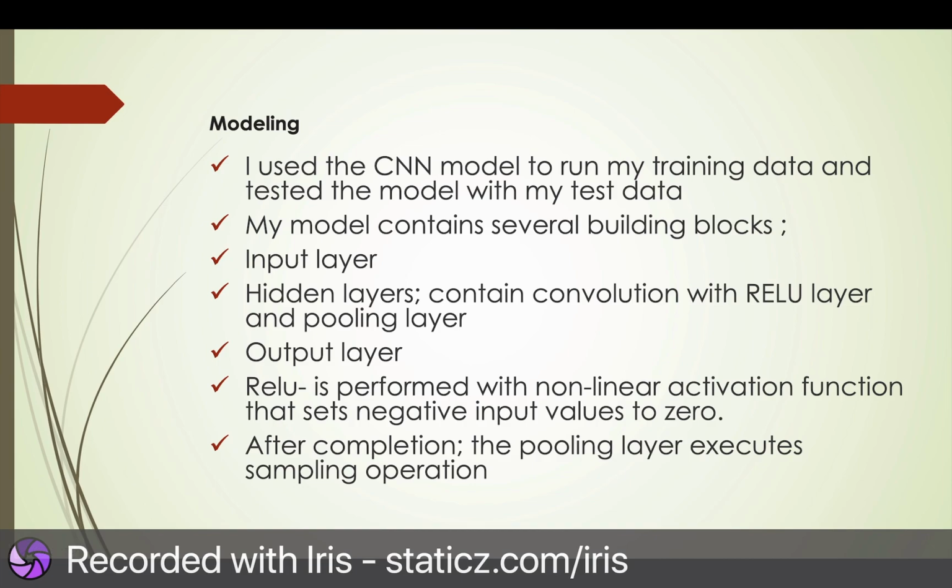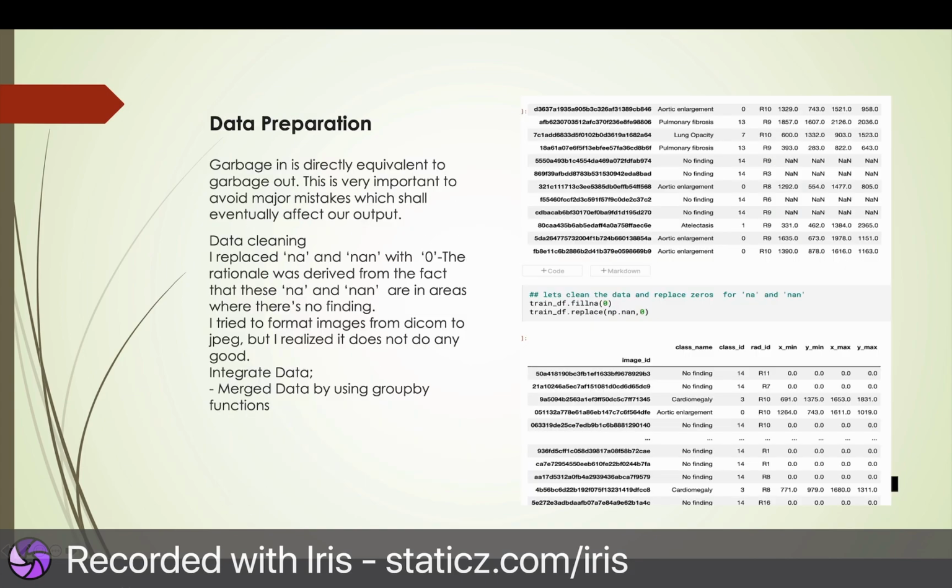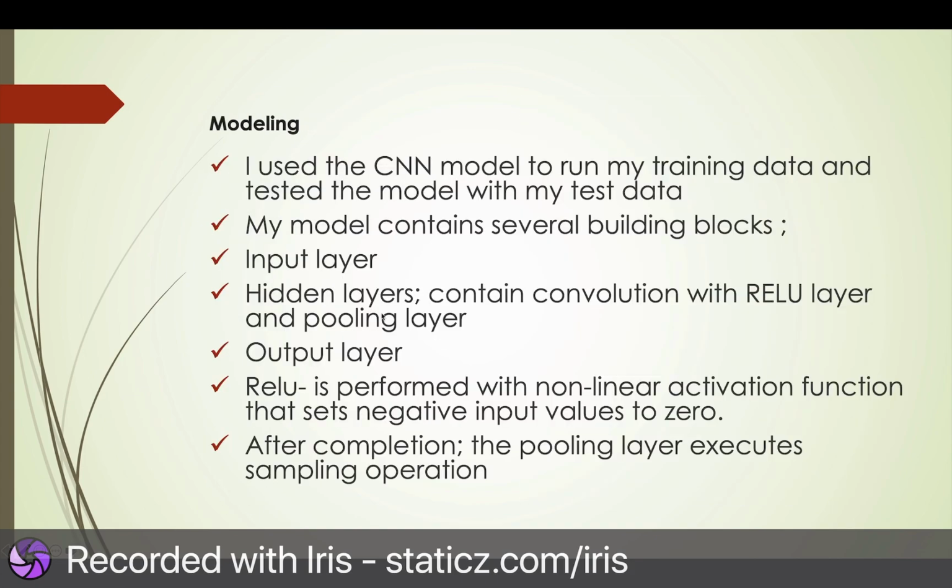It was easy. I changed some of them, but I realized I should leave them in DICOM format, because DICOM format has metadata, other information in those kinds of images, which is really important when interpreting them. So from this aspect of data preparation, I go to modeling.